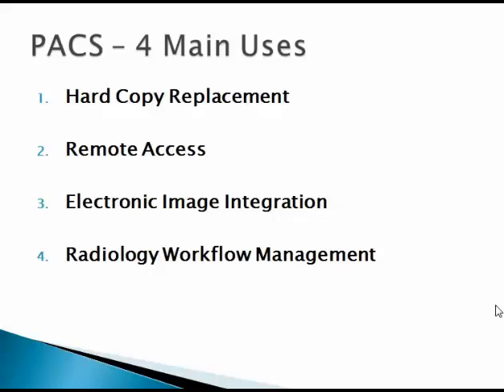Remote access. You can now access these images from anywhere. Much like the EMR, it's often a link from an EMR. You can access images from your desktop, a tablet, or sometimes even your phone. Electronic image integration. You can integrate into different applications such as an EMR or a RIS, a radiology information system, and it improves radiology workflow and management.